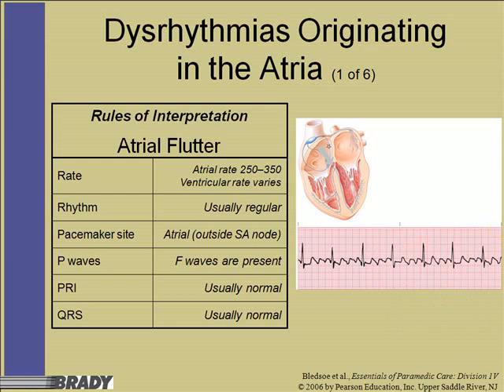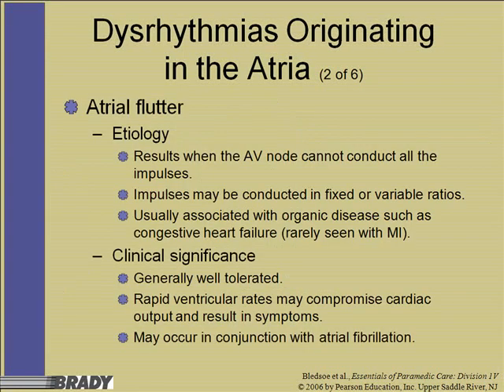Another little trick with this strip is if you have a strip like this that prints out on the monitor and you're trying to decide is this a flutter or a fib, it's a good idea to flip the strip over, and we call it shark tooth or picket fence. If you flip it over, you'll notice the jaggedness of it, but it does have a pattern. Sometimes it's easier to do with your strip if you have a printout.